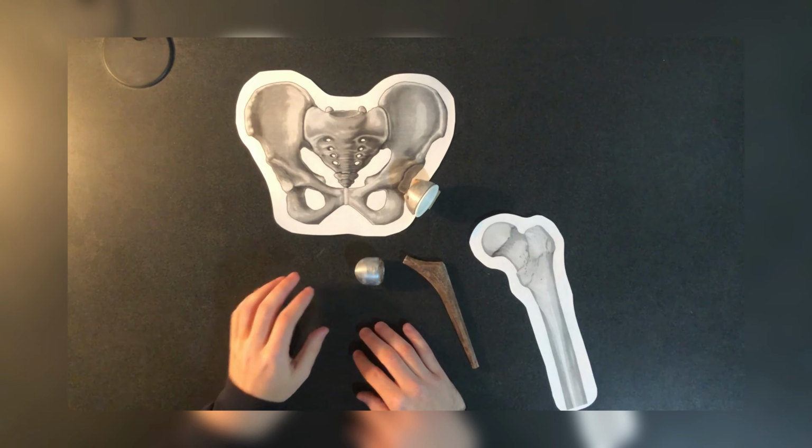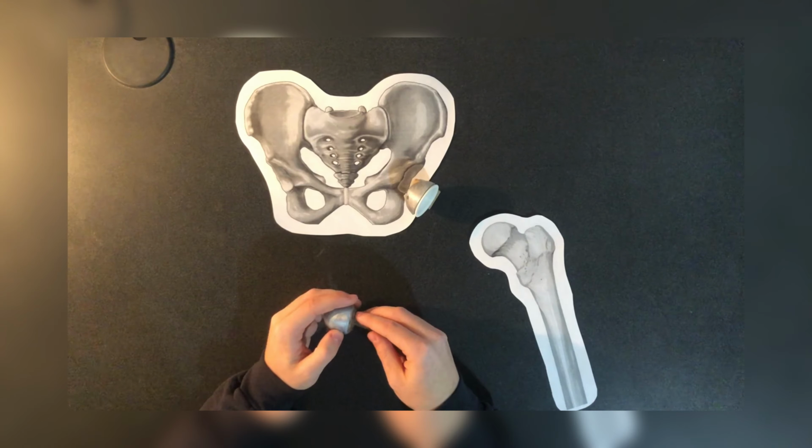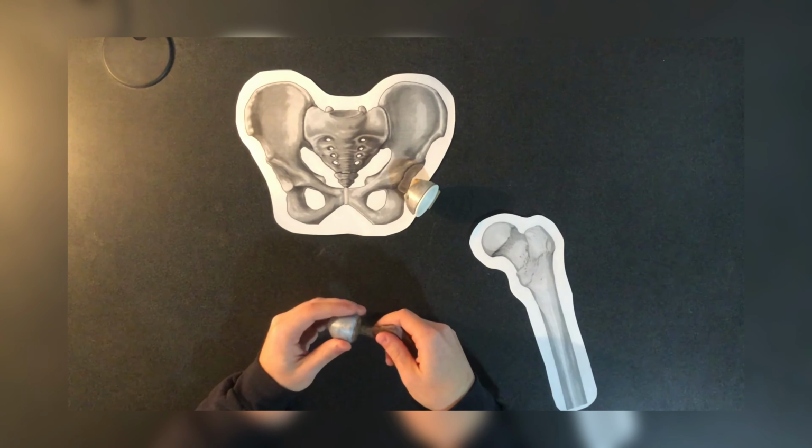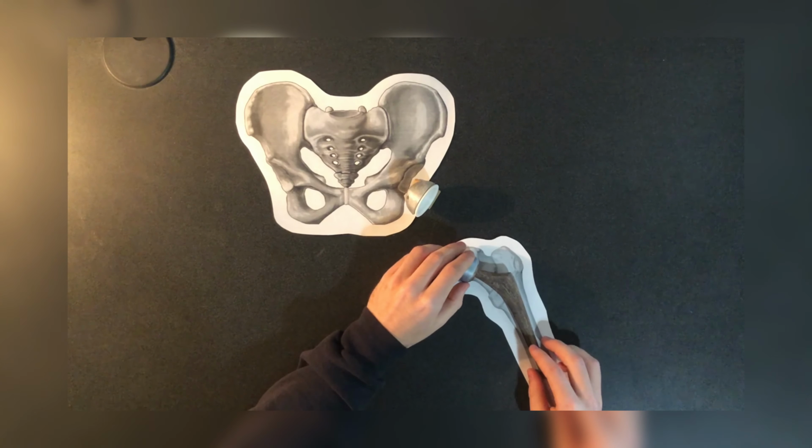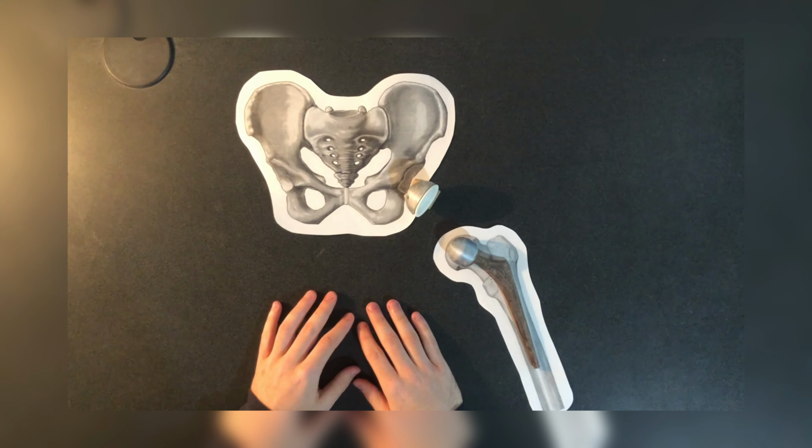Lastly, the femoral head is attached to the stem and is carefully inserted into the femur bone to replicate the natural hip joint's spherical movement. Special care is taken to ensure optimal alignment and positioning of both components to restore the hip joint's range of motion and stability.